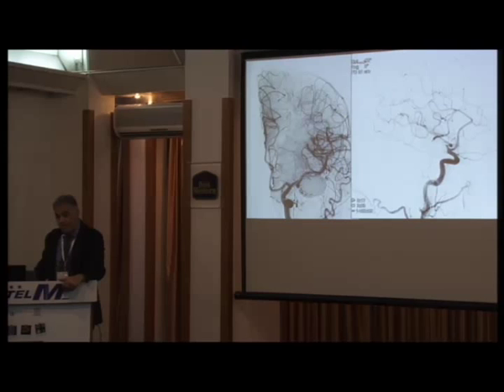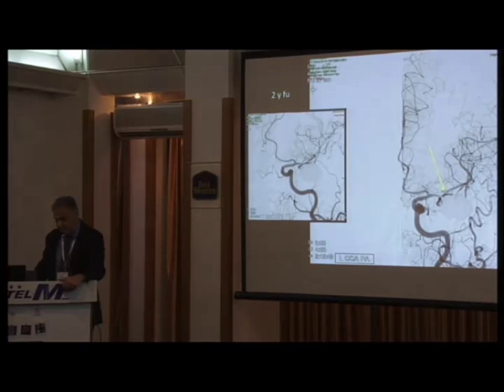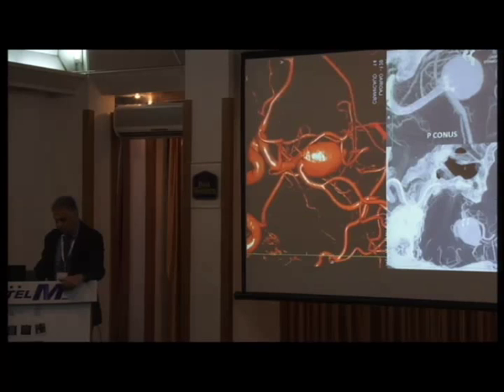But when you follow this group, you start to realize that this is the second year follow-up of this case. Even though you changed the morphology and did a good coiling, there is still something going on at the neck. It is happening especially for very large and giant aneurysms. In the small aneurysm group, the follow-ups are far better than the large ones, I mean more than 20 millimeter. The 10 millimeter for me is not large. I'm not accepting that classification.